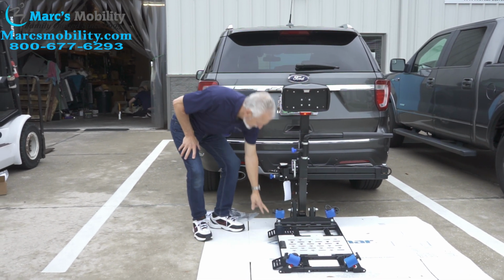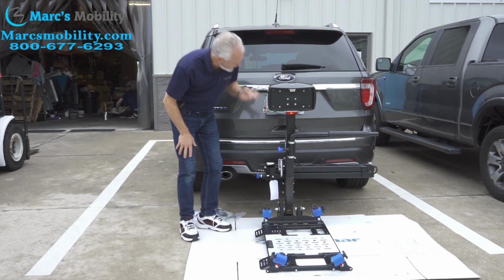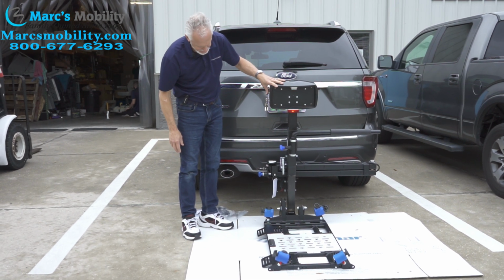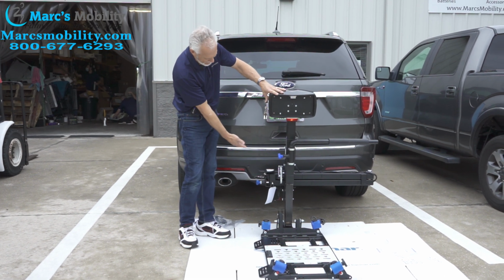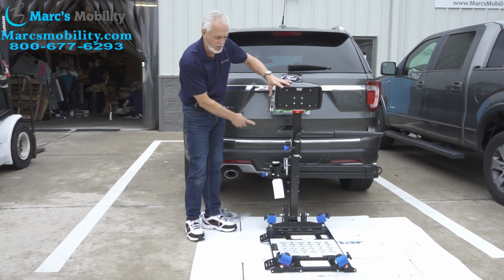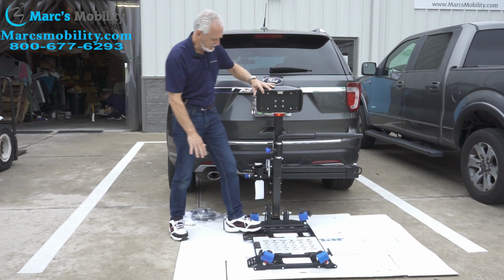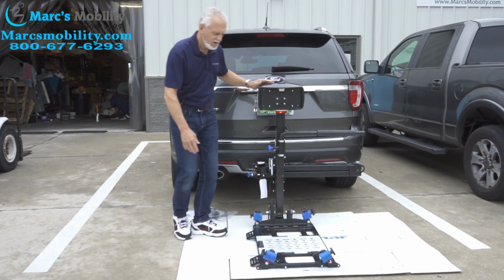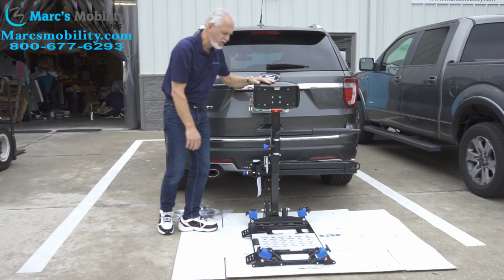You will go down until this corner here touches. That one will touch first, but you want this corner here. As soon as that corner touches, you want to stop, because if you don't stop, you'll be raising the car. You don't want to be raising the car. All you do, you want to make sure it's on the ground, and that's it. Make sure your straps are out of the way before you drive your chair on.